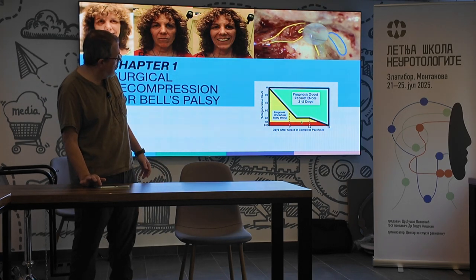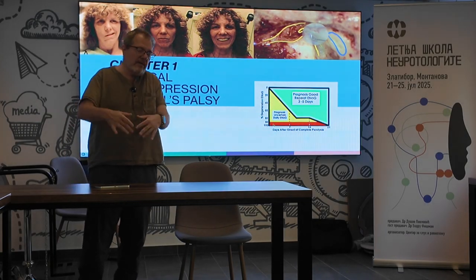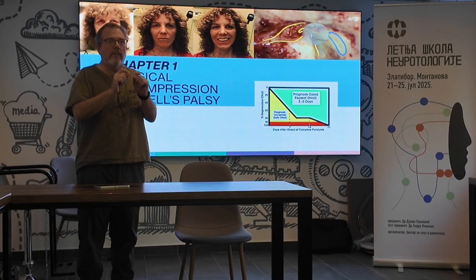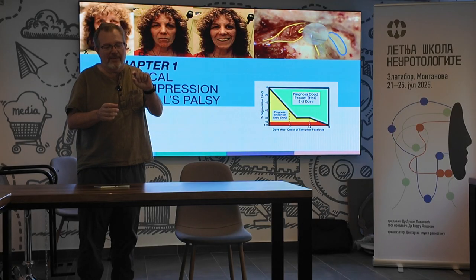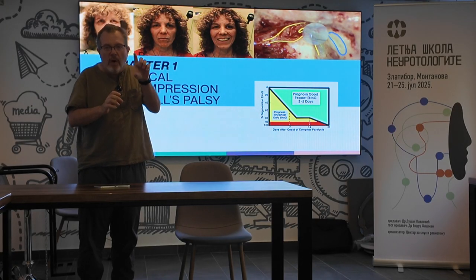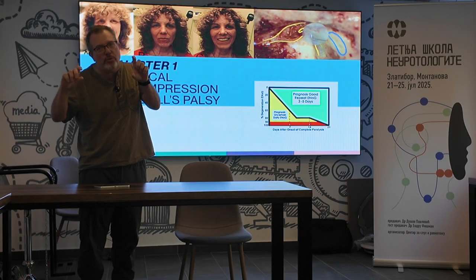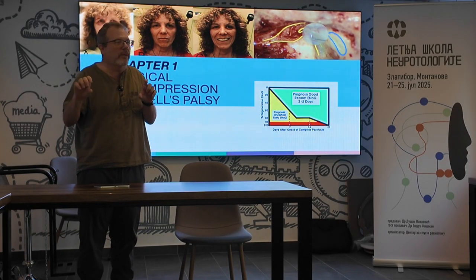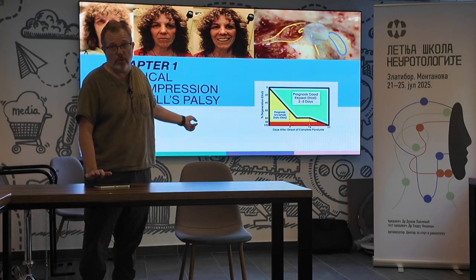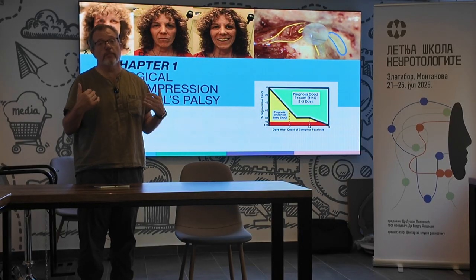But if it drops below this red level, and many of us, like myself, also use 85. I'm not going to say he's 85, he's going to be okay, because the numbers that you get when you do this test, they're only small numbers. It's like 1.0 amplitude as opposed to 0.2. So they're actually small scale. If it goes down to 0.2, I'm going to say that's pretty bad, especially if it's early. And these patients benefit significantly from surgical decompression.